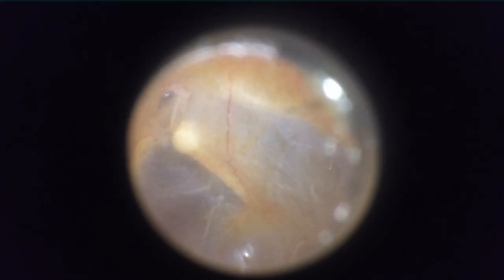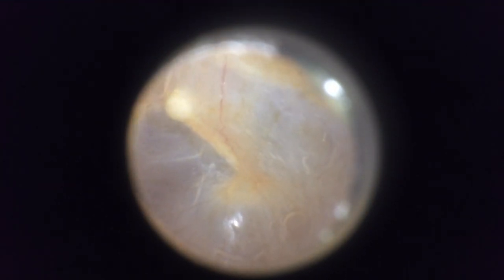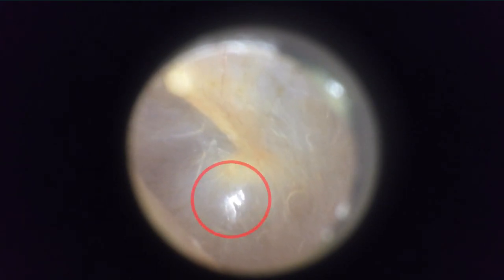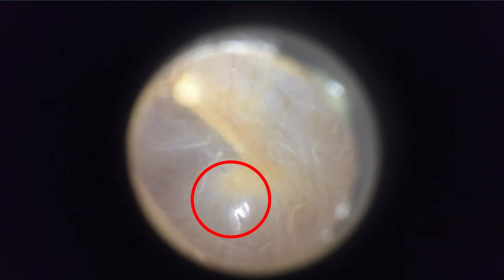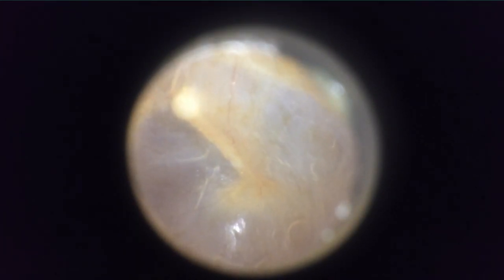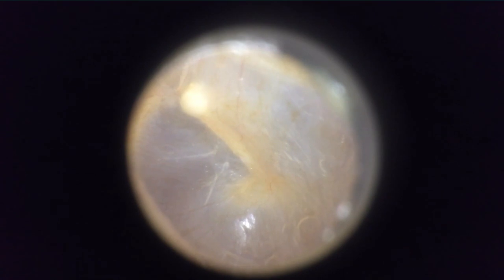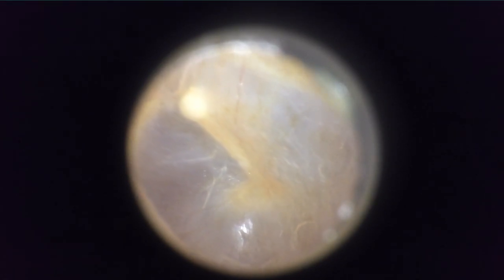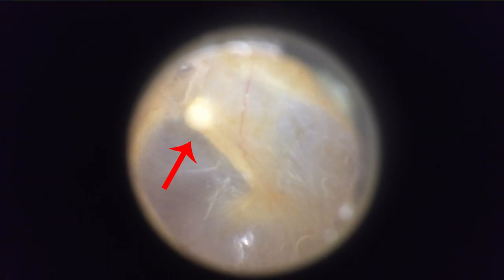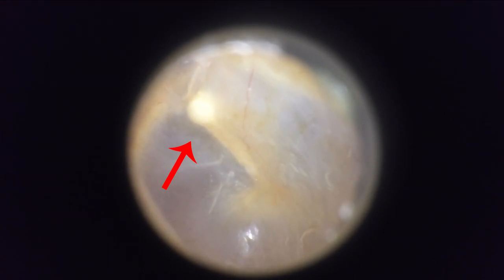I'm going to clean out a little bit more, but what a beautiful eardrum. You can see the small bones — the ossicles — inside the ear through the eardrum. Down in the lower part, that little cone of light reflection is a standard part of a normal eardrum. You've got the stapes, malleus, and — I'm embarrassed — incus. That white one towards the top is the malleus, and you can see part of it touching against the eardrum.